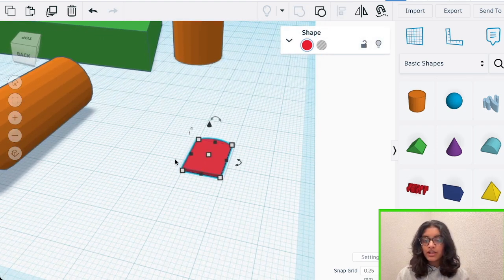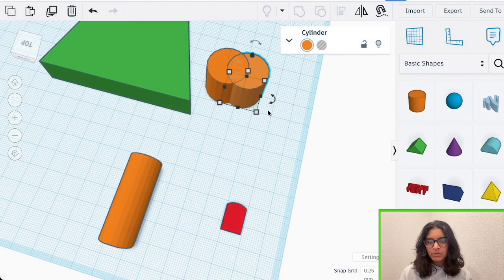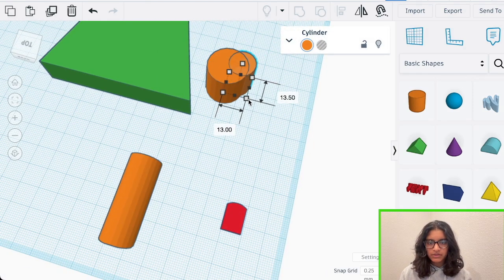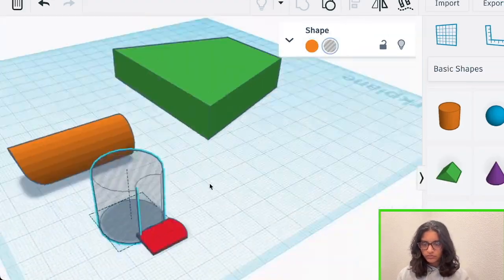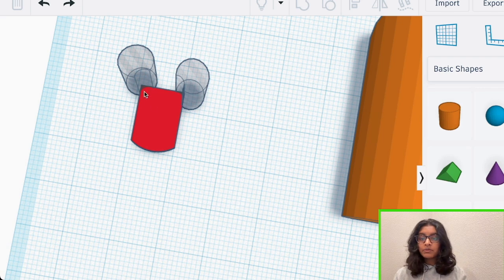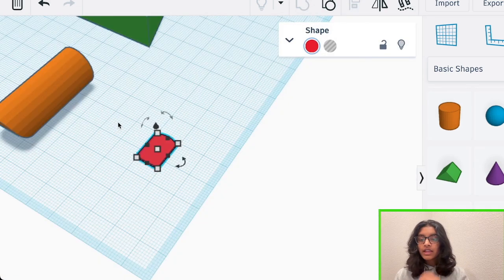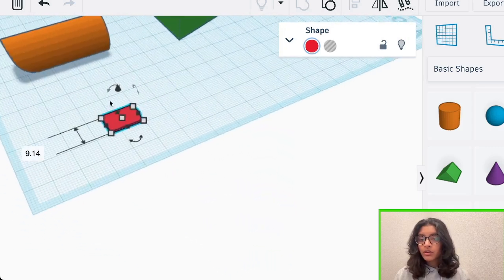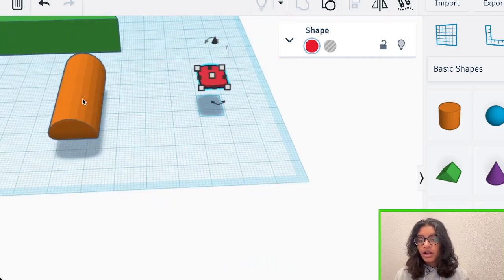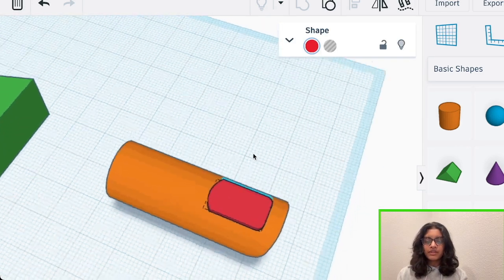And for the top two edges we're going to be curving off, just do the same thing you did before, but instead of using a semicircle as a cutout, we're just going to use a really small cylinder. Just orient the curve on the top two edges of your fingernail and then group all the objects together. Alright, after doing that, we've gotten our fingernail shape, and we're just going to lift it and place it on top of our finger here. You can also adjust the dimensions on this step.